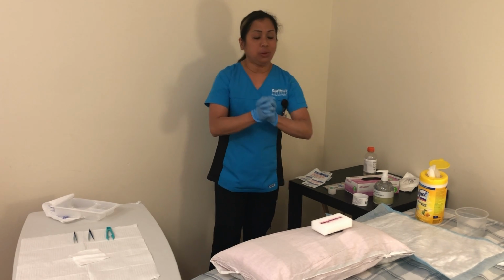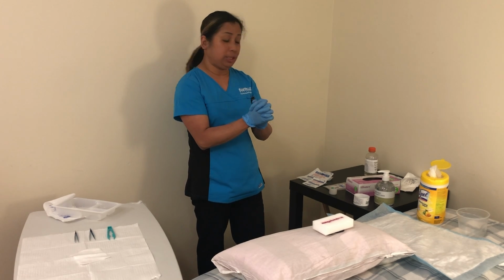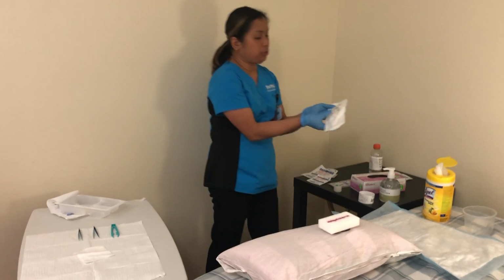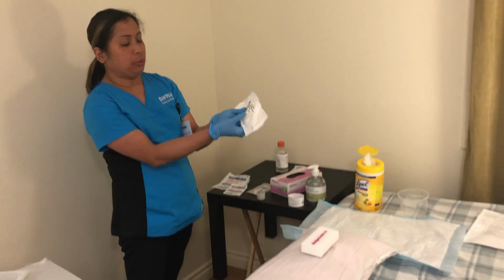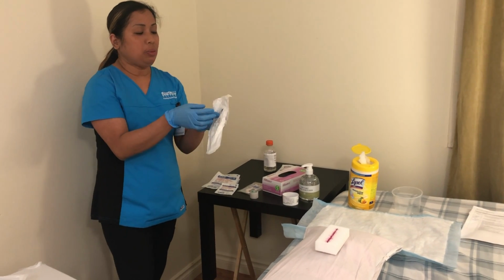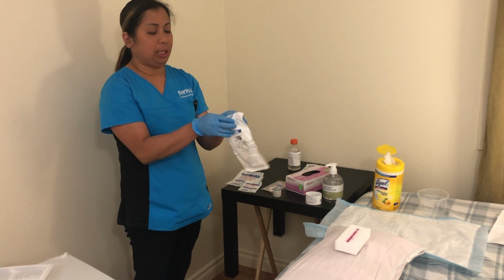Okay, now I will remove the staples. Next, I'm going to grab my staple remover. The staple remover is sterile and will expire on July 10, 2023. I will open this one like when you peel a banana. So I'm going to open it like this.